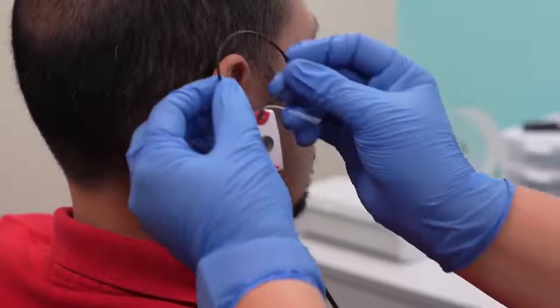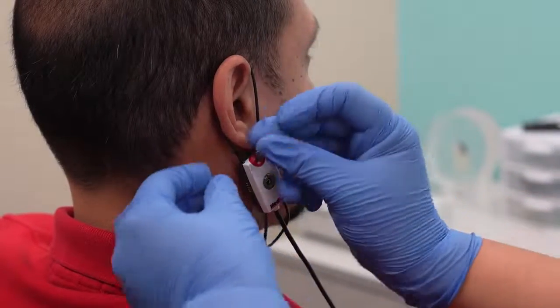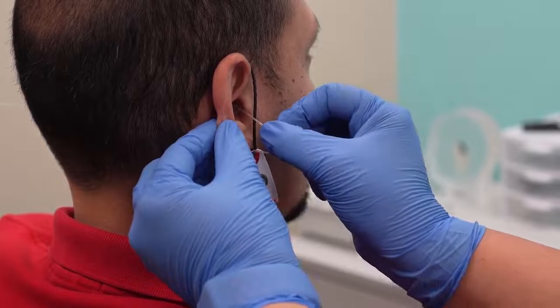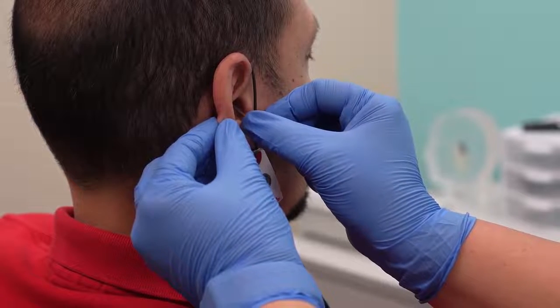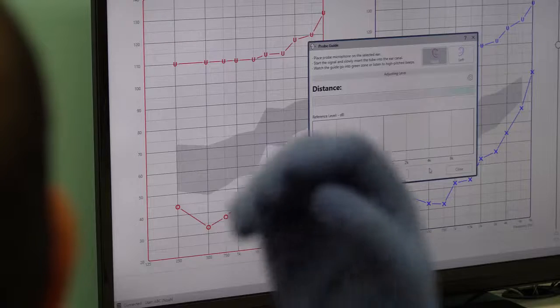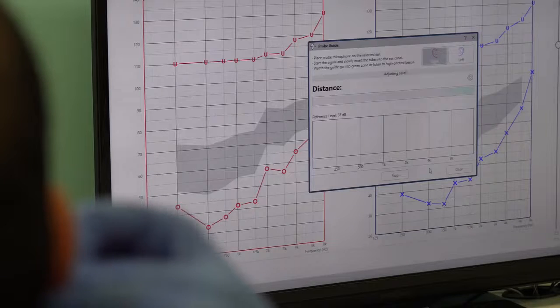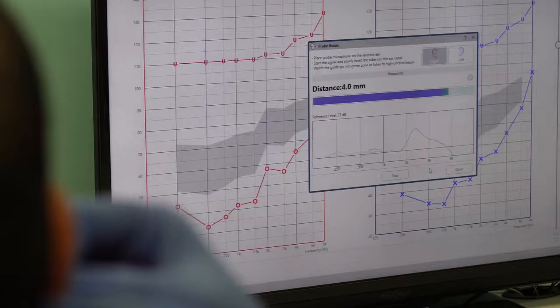Real ear measurements should always be performed with the probe tube sitting between 3 to 5 millimeters from the eardrum. The probe tube depth guide assists in placing the probe tube at that correct depth.